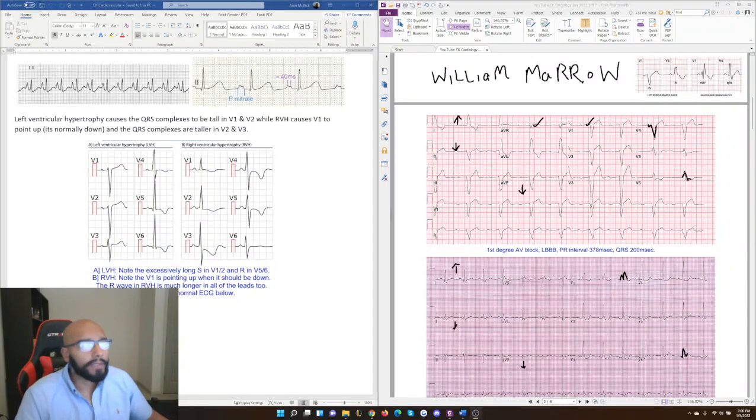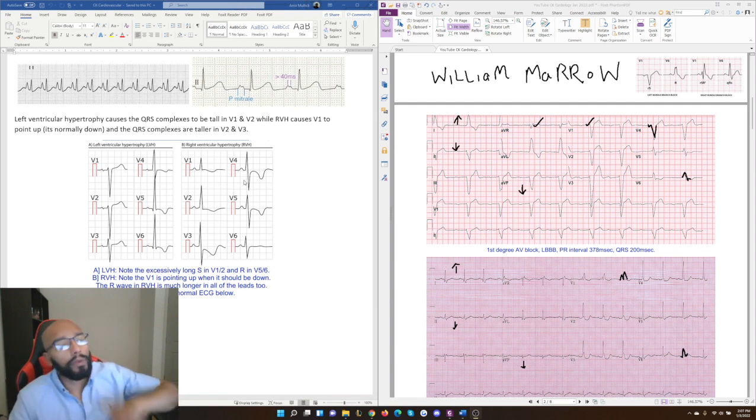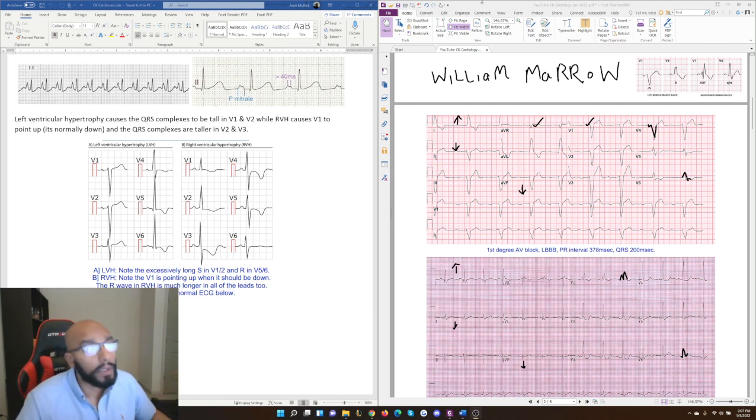All right, so in our last video, we talked about the various changes we see in ECGs, and there's a couple more to go through. And we looked at the STEMIs and NSTEMIs, and we're going to now look at some ECGs to see what it all looked like. Of course, a lot of med students are very intimidated when an ECG is presented to them. So we want to look at as many as we can and really start understanding how we're supposed to navigate our eyes throughout it and really see what we're supposed to be looking for.